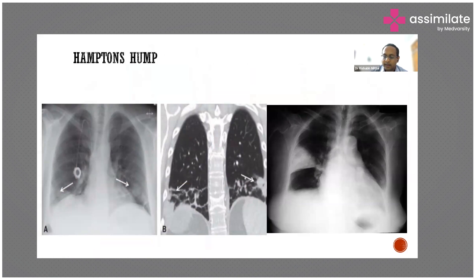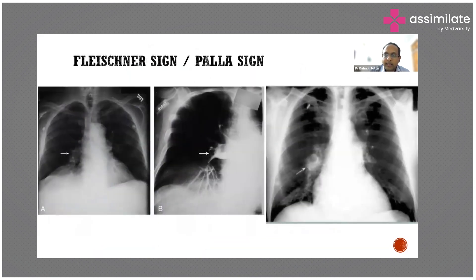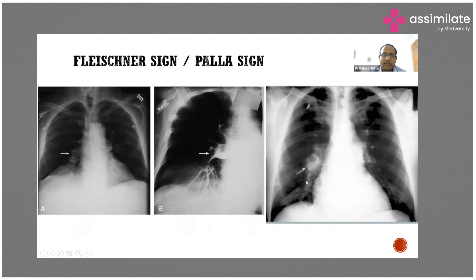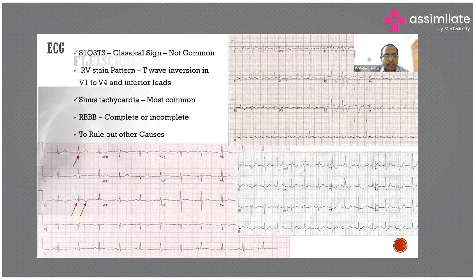This is Fleischner sign — you can see an enlarged main pulmonary artery. The Palla sign shows an enlarged right descending pulmonary artery. These signs are less frequently seen, so we cannot diagnose pulmonary embolism with clinical signs, symptoms, or x-ray alone.